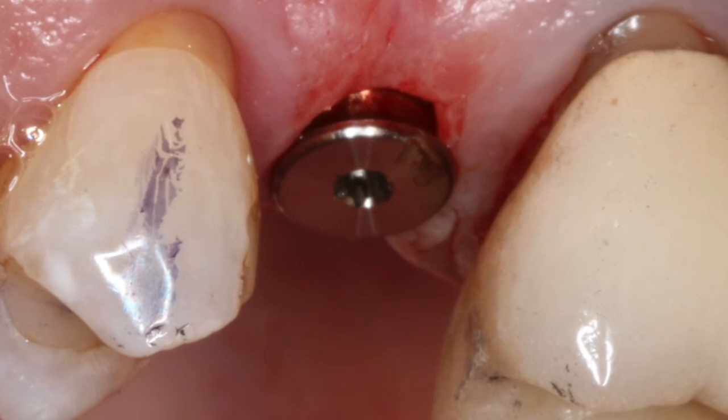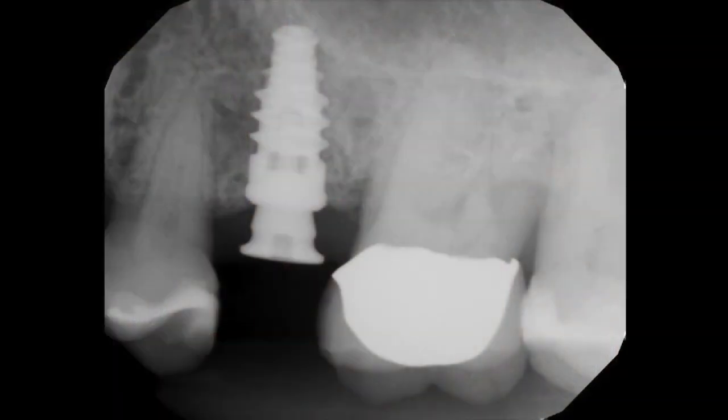The immediate post-operative radiograph shows a nice position of the implant at the floor of the sinus, right at the crest of the ridge. We do have this machined collar with the Hahn system, and that machined collar is a very important part of the system. Dr. Han, who created several implant systems in his career, found that a machined collar allows for biologic width to be established. If we do get some bone loss in that area, the soft tissue responds very well as opposed to having bone loss onto the roughened surface of the implant itself.